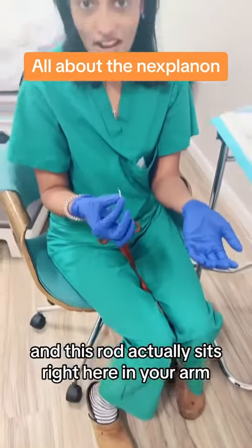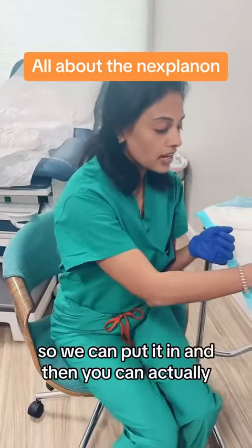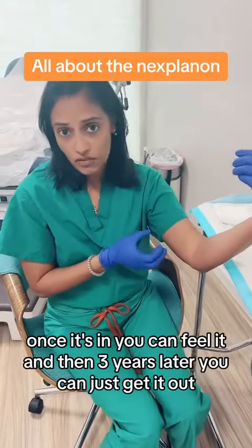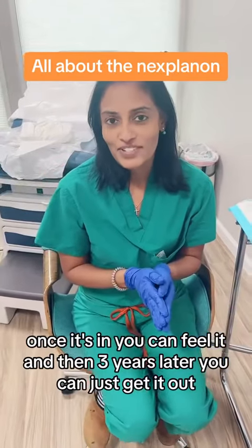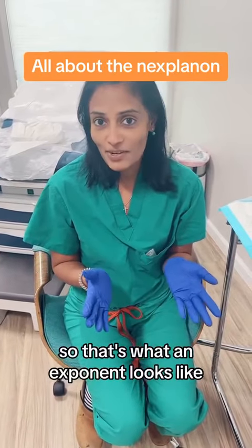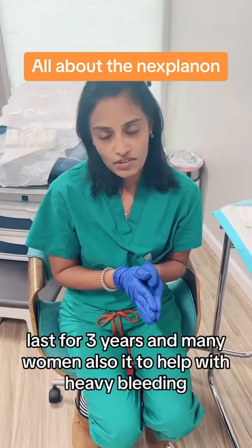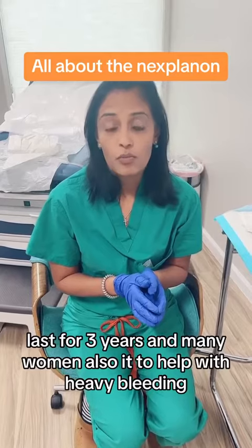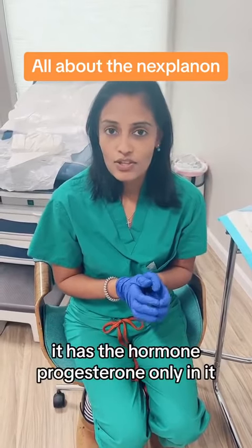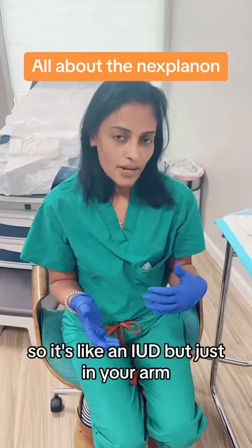This rod actually sits right here in your arm. We can put it in, and then once it's in, you can actually feel it. Three years later, you can just get it out. It's an excellent form of birth control, lasts for three years, and many women also use it to help with heavy bleeding. It has the hormone progesterone only in it, so it's like an IUD but just in your arm.